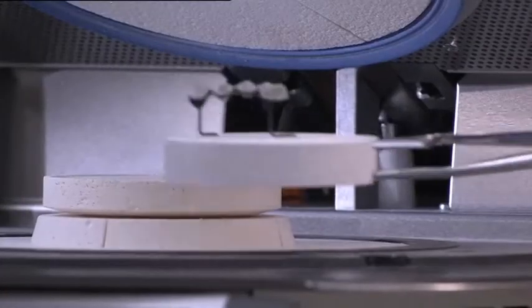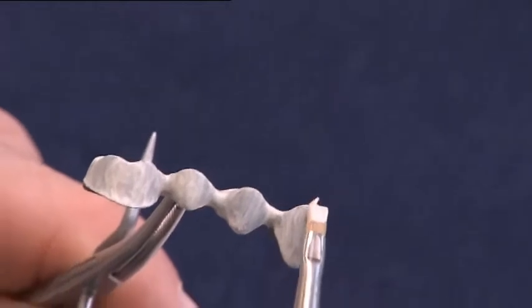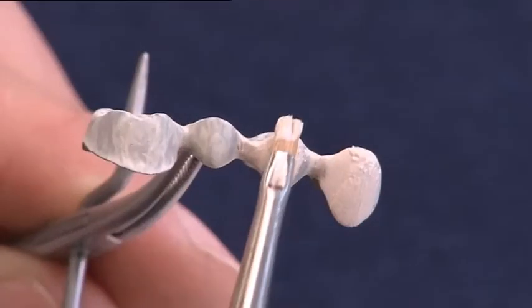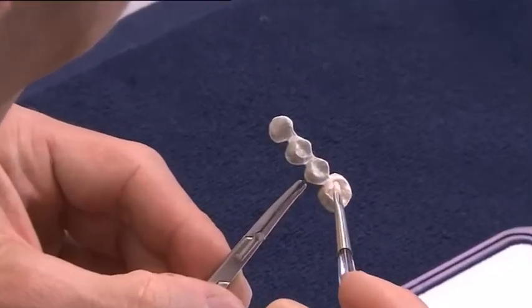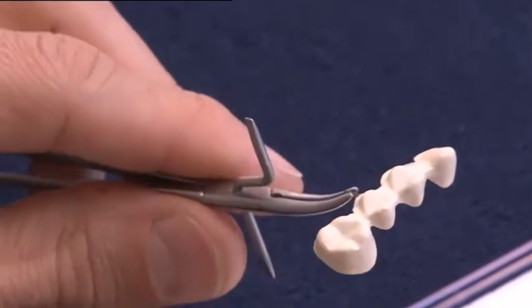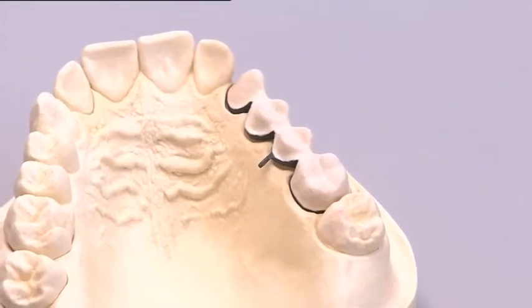The second opaquer layer is applied in such a way that the framework is completely covered. For a characterization of the opaquer layer, intensive opaquers may be used. After firing, the opaquer should demonstrate a silky matte gloss.